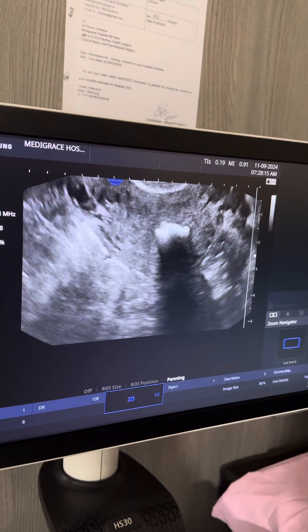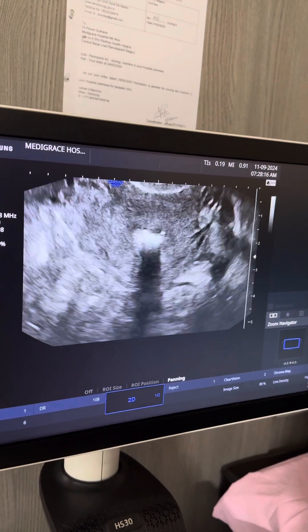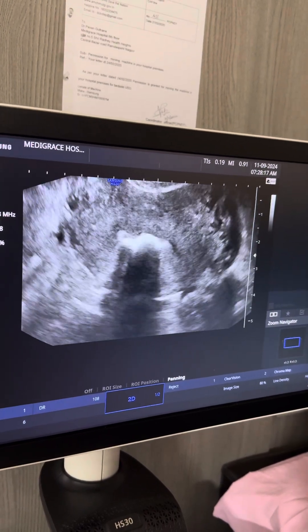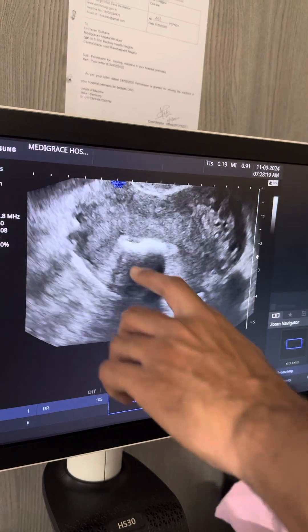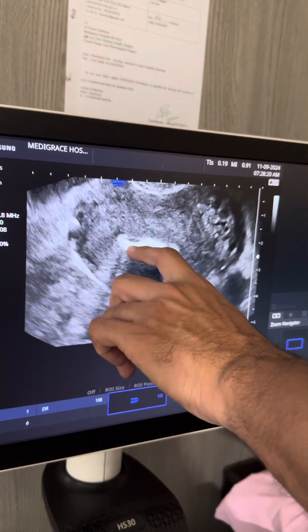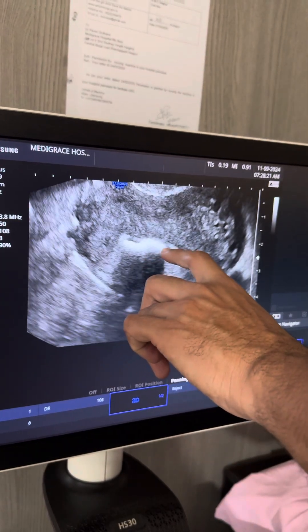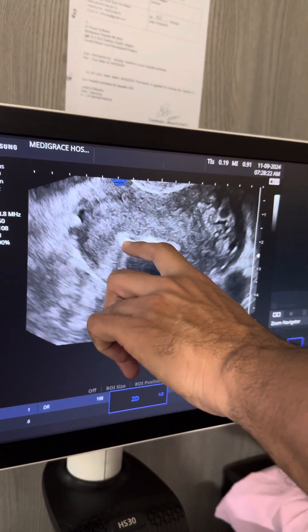This is the transverse image, and you can again notice these bone sheets in the endometrium.